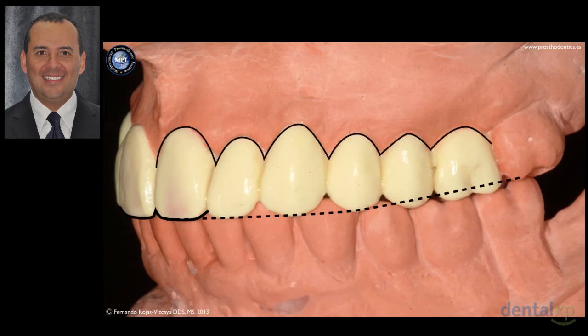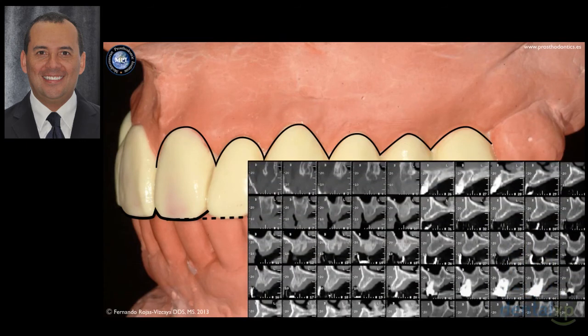After that, what is the margin of the new crown? The maxillary central incisor is 10.5 millimeters, so you can see that it's a natural size proportion of this teeth. We have a good relationship between central, lateral, and canine and the posterior teeth. We sent the patient for tomogram as we made with the molar or with the lateral that I showed you before.